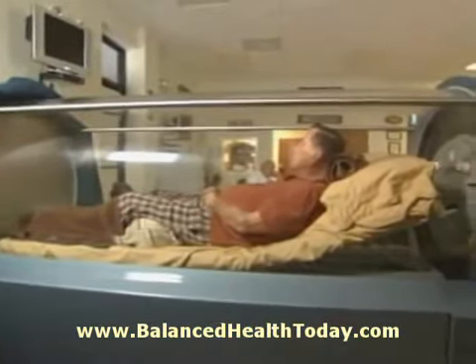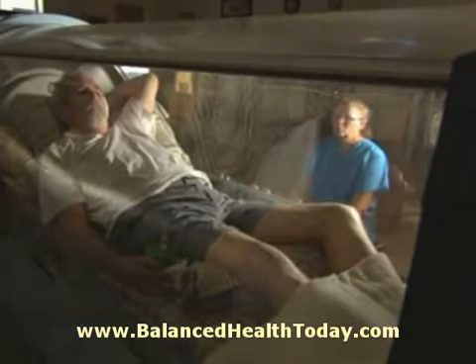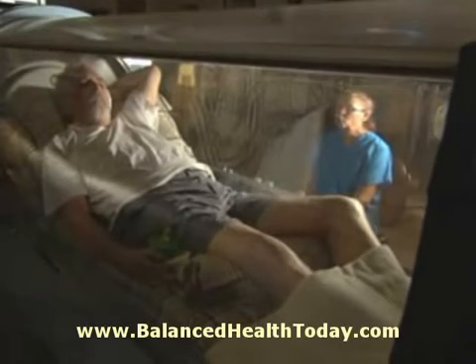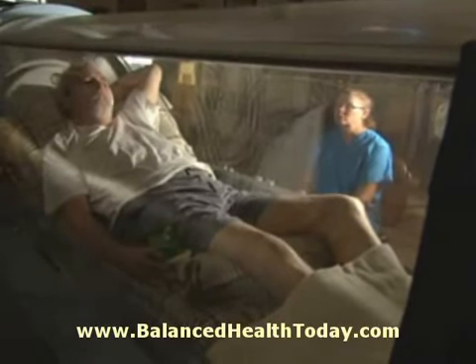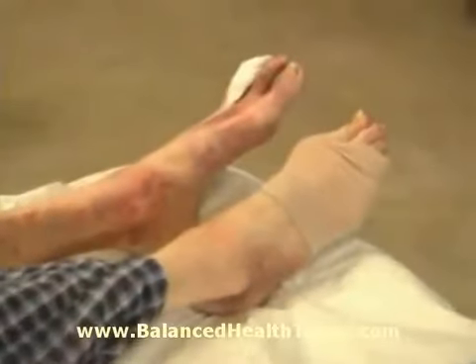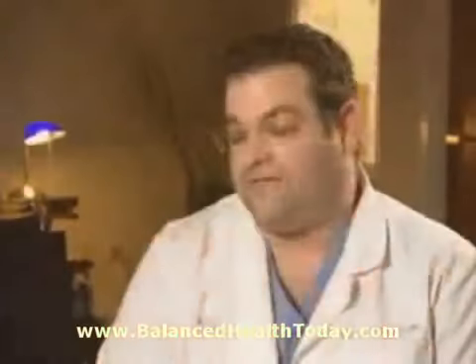Treatments range from 60 to 120 minutes. There's different pressure protocols set up for different types of treatments. Your wound care treatments go to a deeper depth for a longer period of time. Hyperbaric therapy has been proven effective for treatment of non-healing wounds when standard conventional wound care has shown no measurable signs of improvement. The breakdown of tissue and lack of perfusion can be the cause of many such wounds.